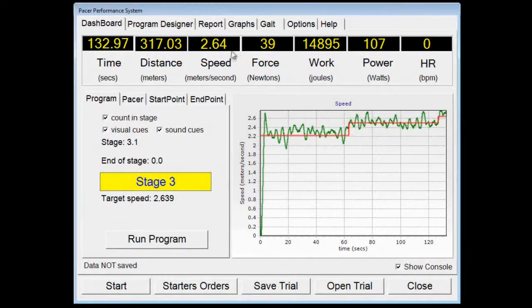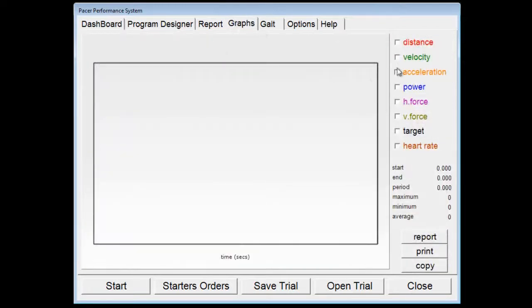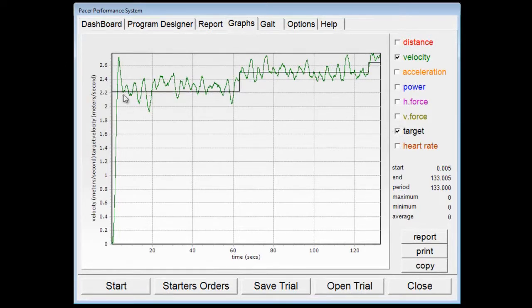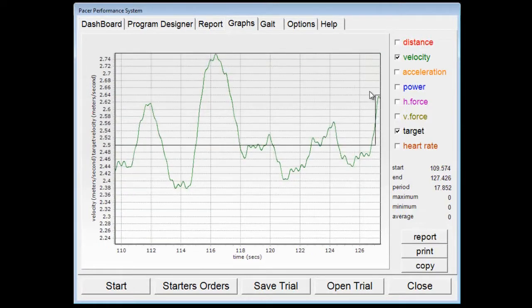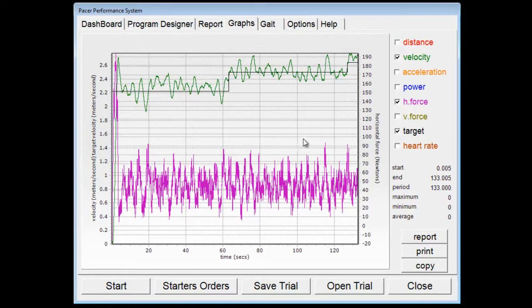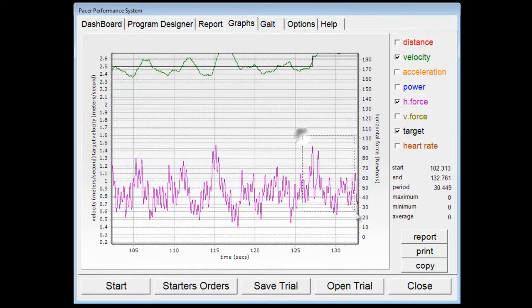Once you've stopped the program, we can go into the graphs and have a look at the data. The first graph shows your velocity compared to the target — the target is the speed they were supposed to be travelling, and the green line is their velocity. You can zoom into any portion of the graph you'd like to see their velocity at that period. You can also show their horizontal force and zoom into that portion of the graph as well.